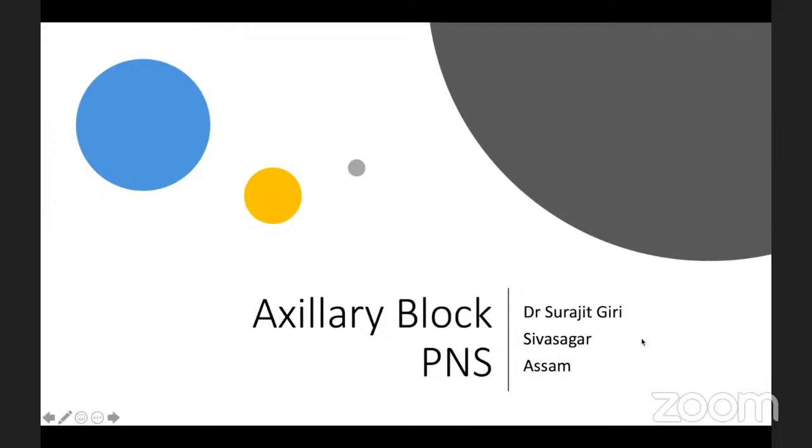So the current was decreased, and I slightly withdrew the needle so that I could get the twitches at 0.3. I have deposited 30 ml of local anesthetic there, and then the block was assessed with sensation and 3 P's. So this is ice brought from the freezer, and we ask him whether he is getting the cold sensation or not.